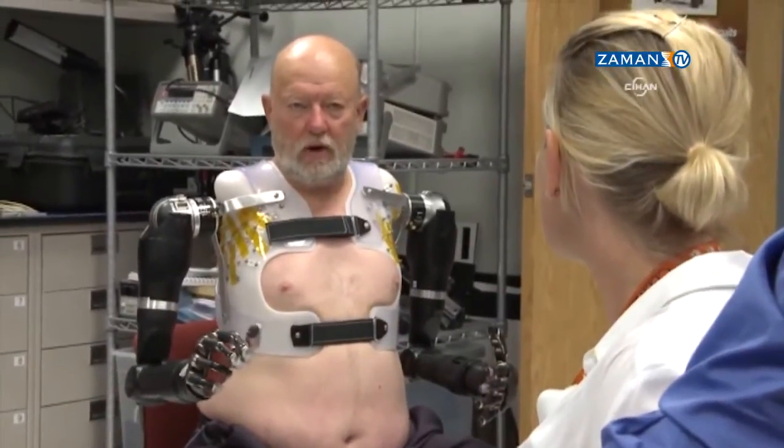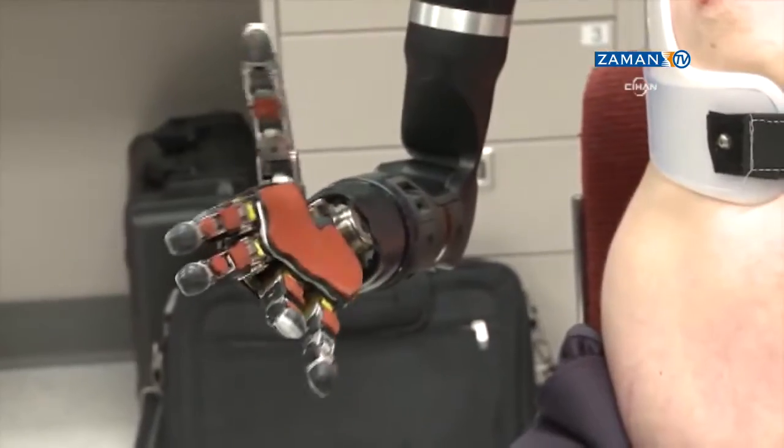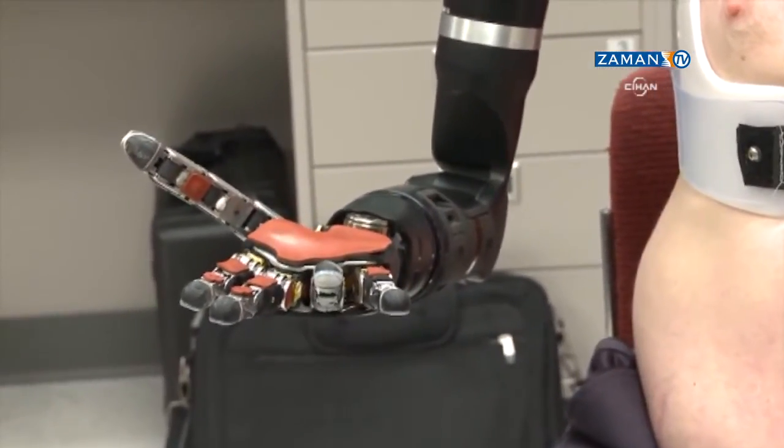So he needs to position the shoulder, then the elbow, then the wrist, then the hand, separately and rest in between. Maybe I'll be able to, for once, put change in a pop machine and get the pop out of it.